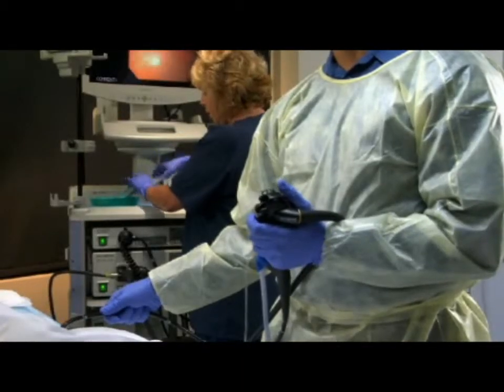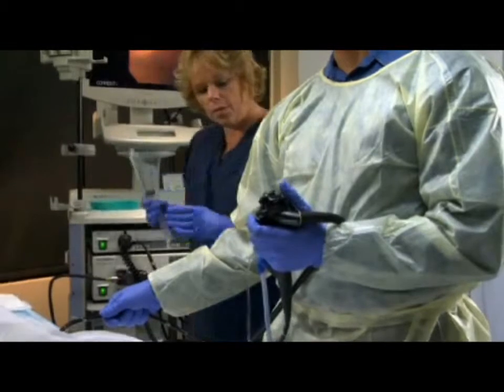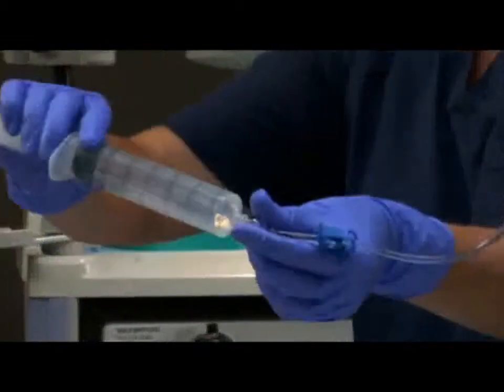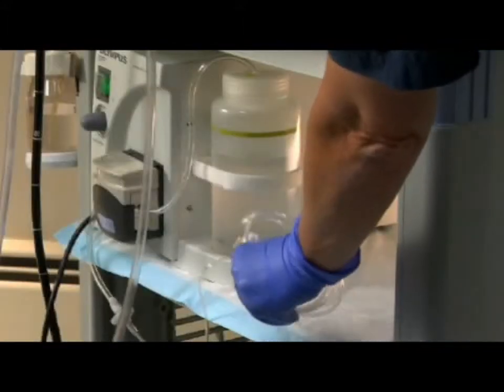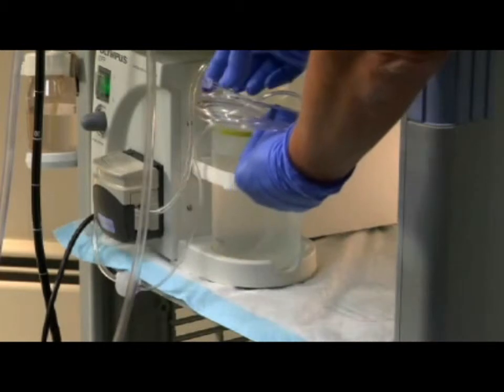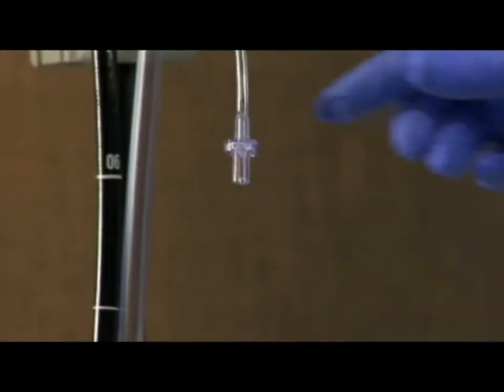If irrigation is needed for the procedure, there are two options. Option 1: connect the irrigation line to a 60 cc syringe. Option 2: connect the irrigation line to a water pump.